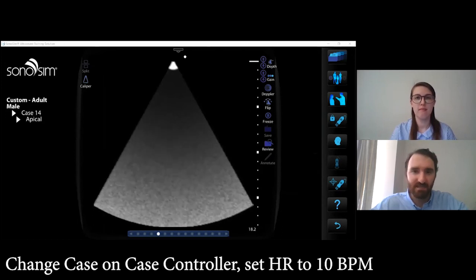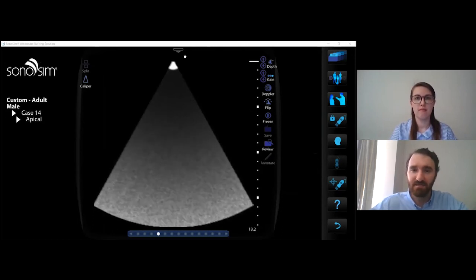Now let's say we finished the scan and the patient loses consciousness and we notice that the vitals, there's no palpable blood pressure anymore. What would we do next? Okay, well, the first thing I would do is get airway and breathing support, and then I would have them start CPR. And then during CPR, during the pulse checks, I would do another cardiac exam to examine their heart.